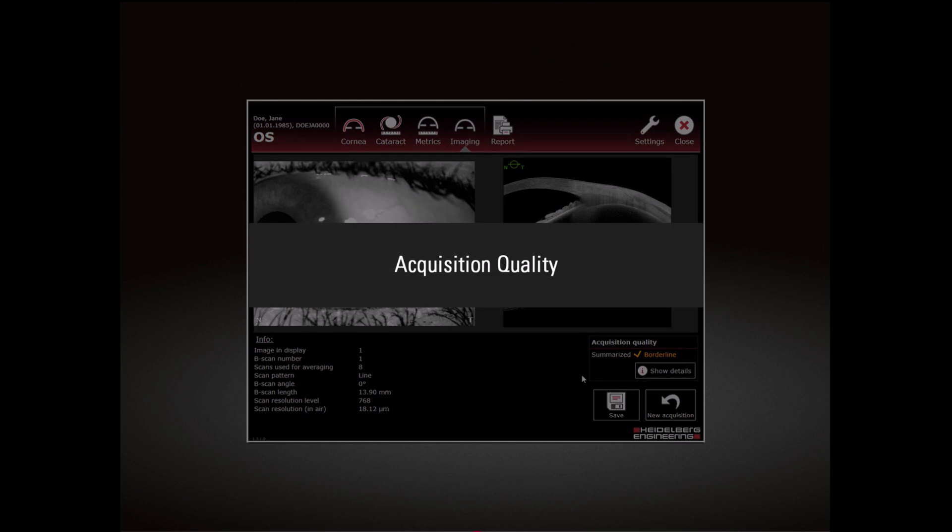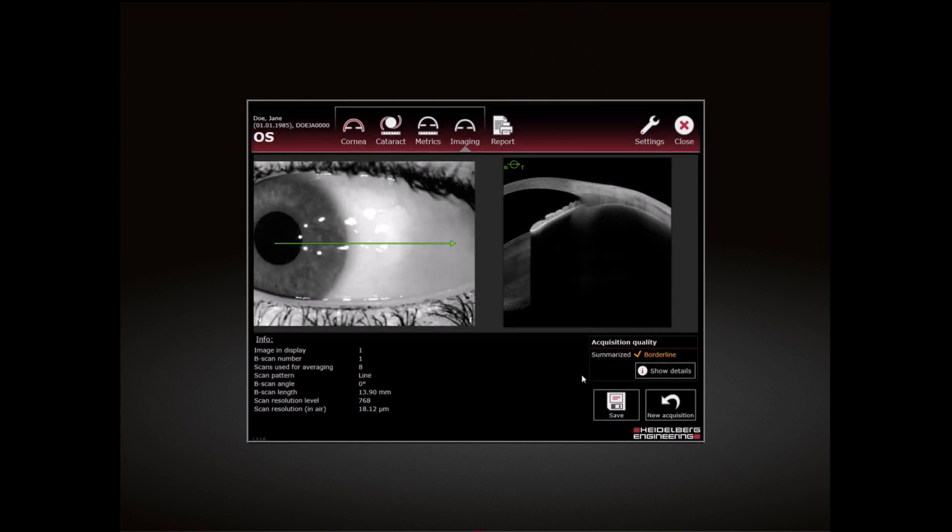Acquisition Quality: Because of disabled tracking, you always must save the measurement manually if you want to keep it. Note that the acquisition quality always is displayed as borderline for a scan with tracking off.